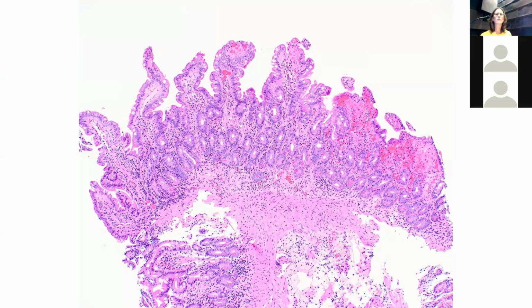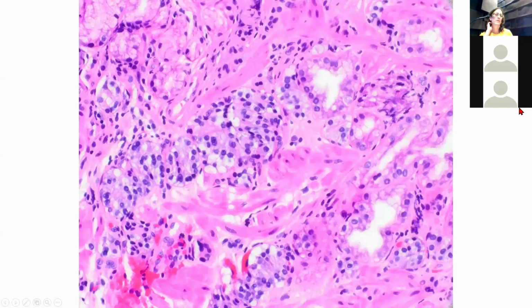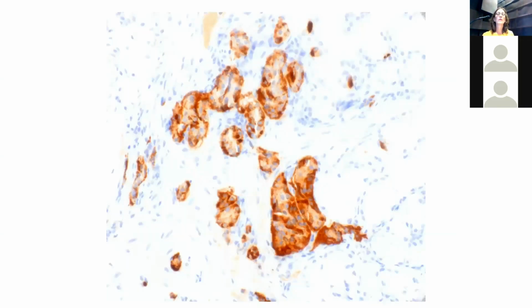And then I was very confused, and I looked and looked, and then I found this. See it? And there's more of it. And apparently the endoscopist had encountered a firm area. And there's a gastrin stain. So this is what modern Zollinger-Ellison looks like. And it's sneaky and tricky. And I don't even want to think about what I screwed up the next day.